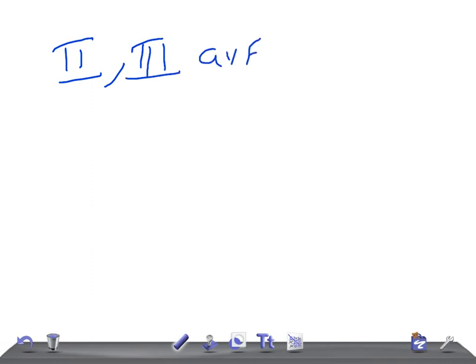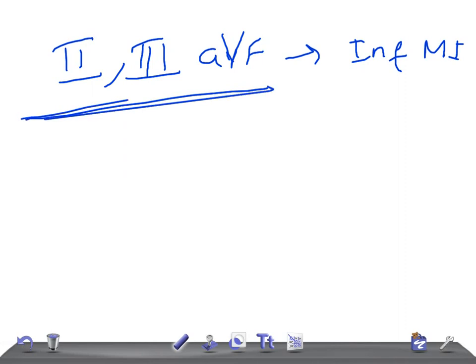You should never ever forget this one: if ST elevation is in leads II, III, and AVF, it's going to be inferior myocardial infarction. Very important — II, III, AVF. We call it 2, 3, AVF for inferior myocardial infarction.